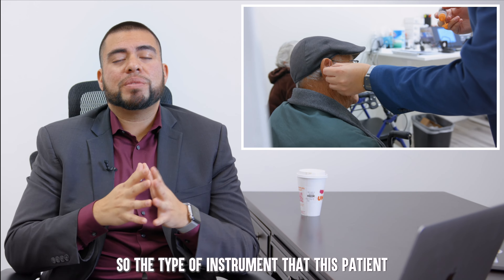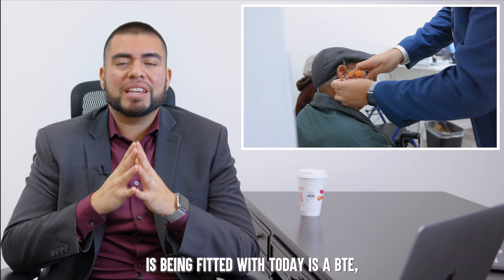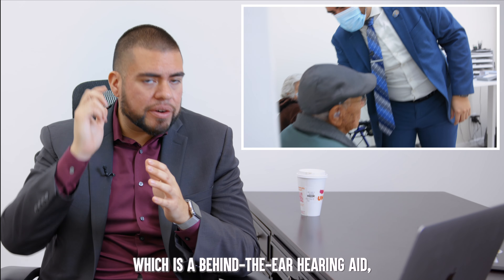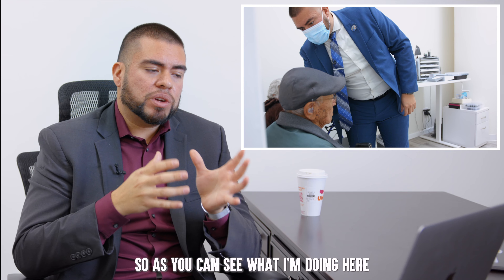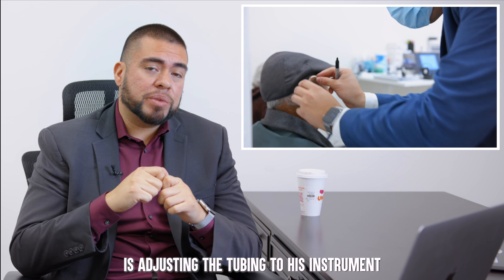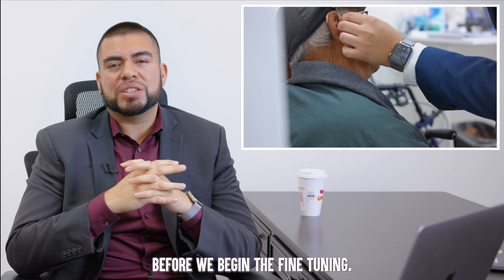The type of instrument this patient is being fitted with today is a BTE, which is a behind-the-ear hearing aid, which also requires ear molds. As you can see, what I'm doing here is adjusting the tubing to his instrument before we begin the fine tuning.